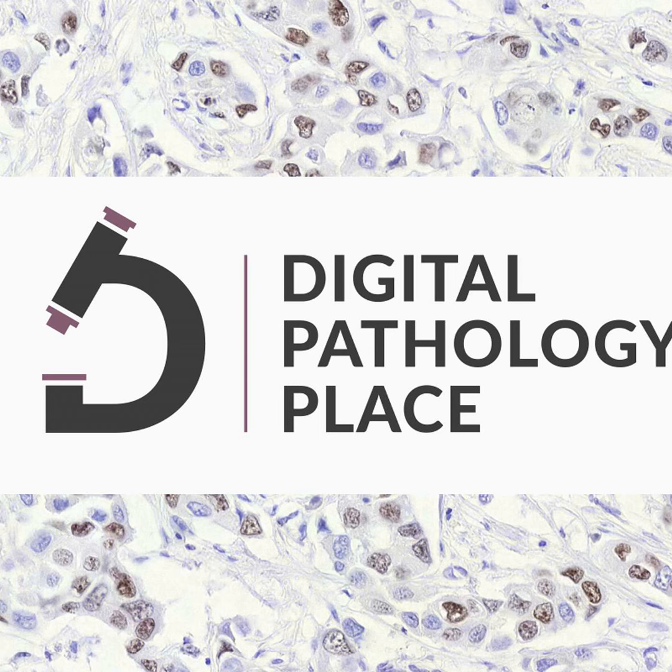I think it doesn't matter what system you want to teach, AI or human, you need to have a good study book. And basically what they are doing is creating not rules, but the book for the AI, what needs to be studied. Examples of cancer, examples of benign, examples of mitosis, what is stroma, what is epithelium, what is not related, what is basically different types of tissue like lung tissue, prostate, so there are a lot of subdomains even in the pathology world.